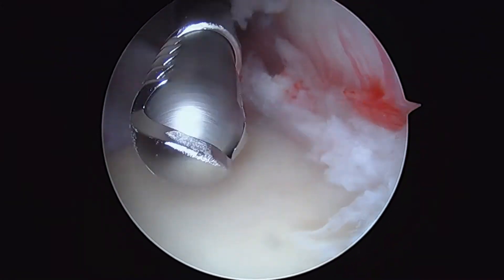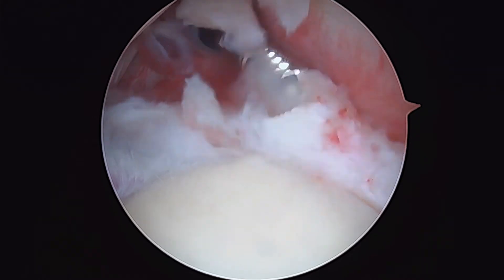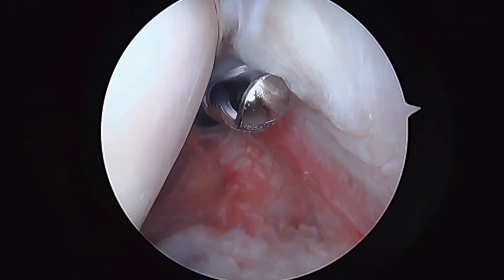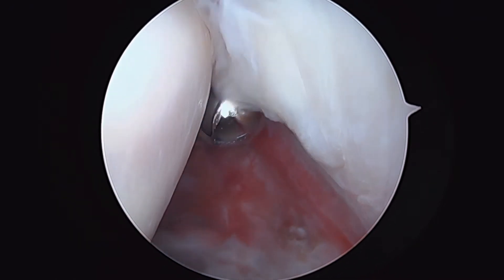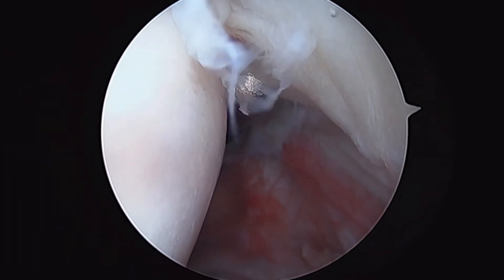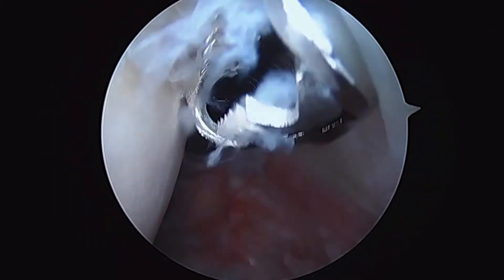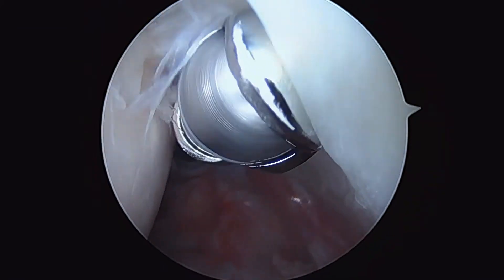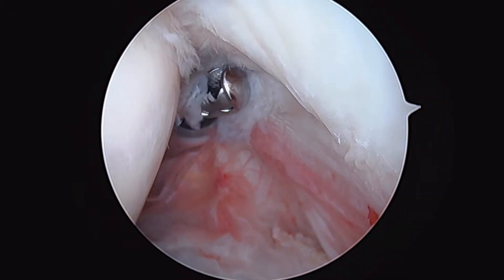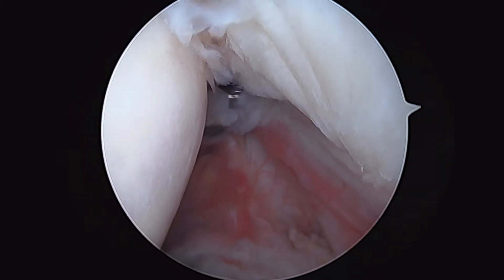That's looking better. Now this is where the rotator cuff has that little full thickness tear right here. We will take an O-PDS suture or a number one PDS suture. This is some undersurface fraying of the cuff, but this is not that bad. We're going to check on the other side, but we know up at the front here that the imaging showed us there was a complete tear, or at least a 90% tear.